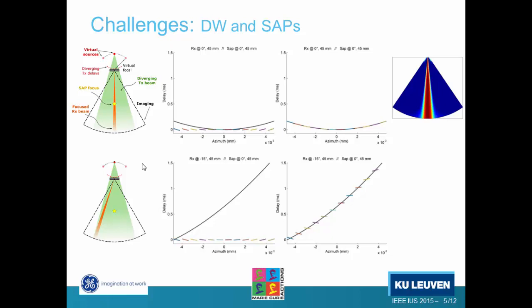But then they have been pre-steered in a non-optimal way. So what we end up with is a main lobe in the desired direction, but we also get energy from a secondary direction, which is called the grating lobes.